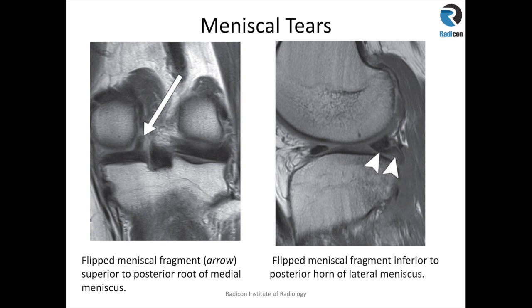There are cases of meniscus tear where things can be misread by a radiologist. Meniscus flaps or flipped meniscus fragments can lie close to the meniscus roots. In this case you can see a rounded area of low signal intensity close to the posterior root attachment of the medial meniscus. There shouldn't be anything between the cruciate ligaments and the femoral condyles in this area, as the meniscus root attaches onto the tibia. This is pointing more towards the femoral condyle, so suspicion should be raised about a meniscal flap in this region.